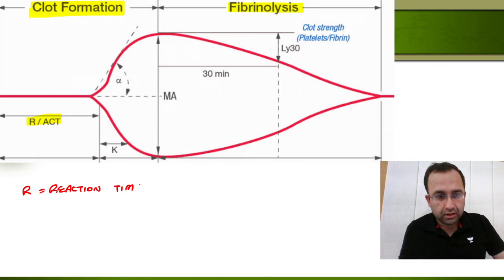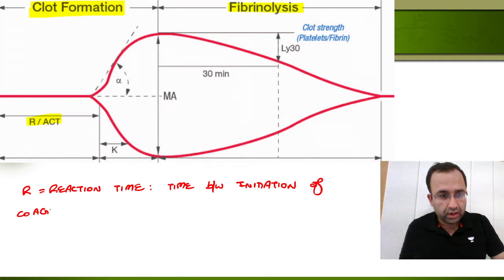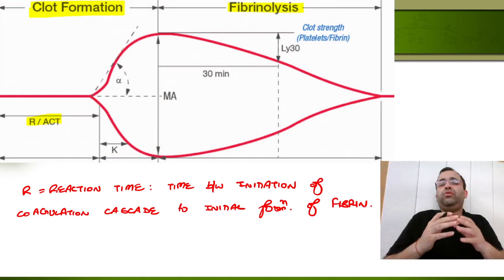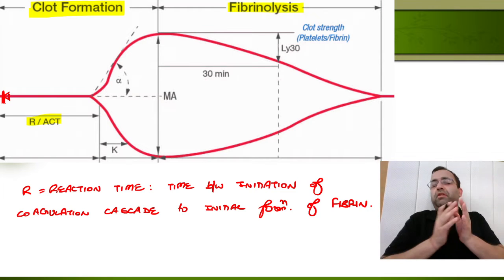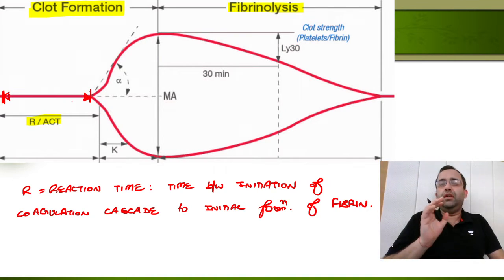Starting with R, the reaction time. It is the time between initiation of coagulation cascade, which is where the coagulation cascade has started, to initial formation of fibrin clot. That is what we mean by reaction time.